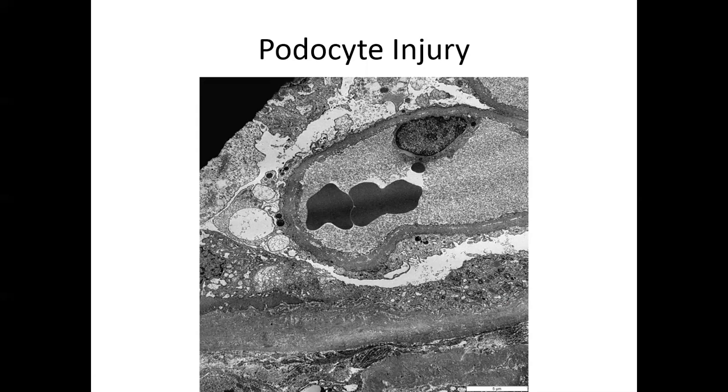And some of those same antibodies, to look at presence or absence of autophagic vacuoles, have been applied to human renal biopsy material, and they have seen a decrease in autophagy of human renal biopsy material with this diagnosis. So it's probably the new, hey, let's try to promote autophagy as a new drug.